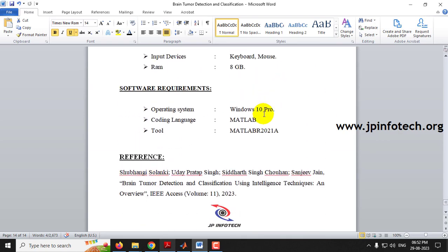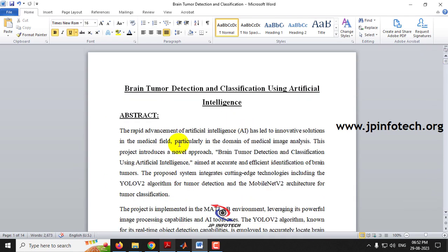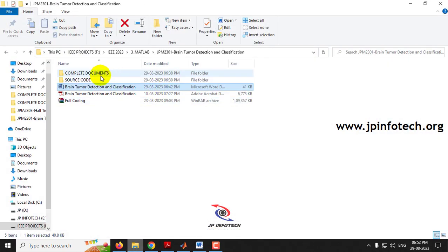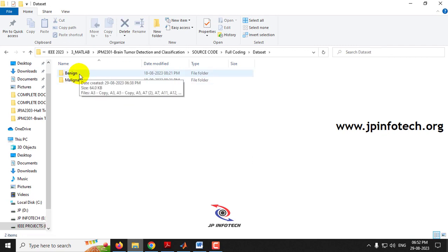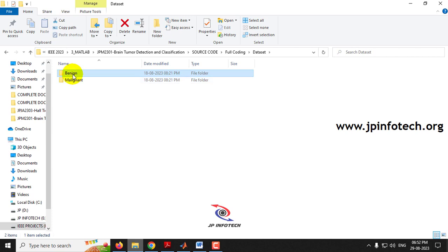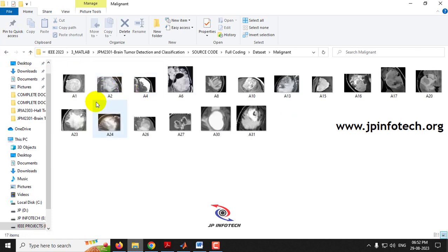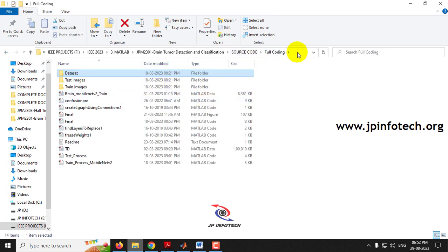The coding language used is MATLAB, specifically MATLAB R2021a. The dataset contains two folders — benign and malignant — with corresponding MRI images available in each folder.